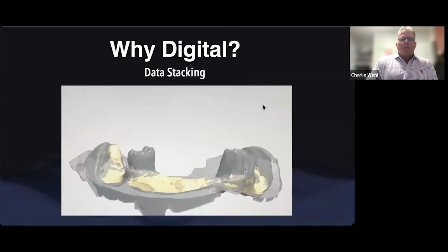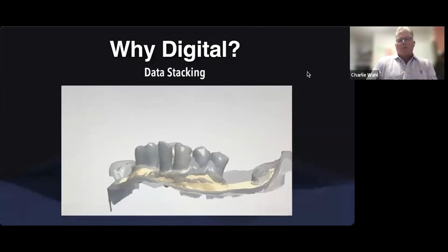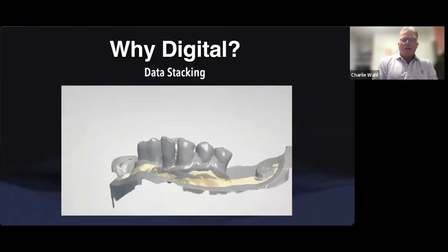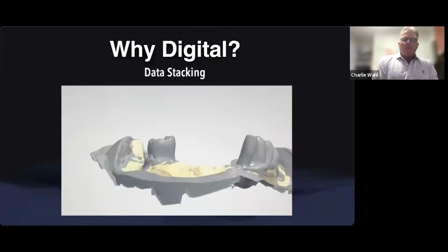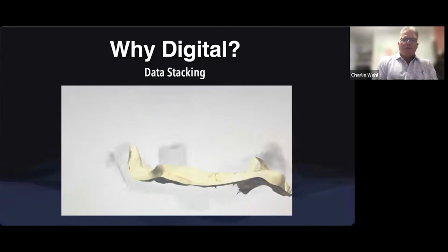And then data stacking. Sometimes we don't get enough information in our intraoral scan, sometimes we just need more information, and this is where immediate dentures are a home run digitally, because in the analog world, if we just saw these teeth off, we lose all reference points. Well, digitally, I can stack different scans over the top of each other.